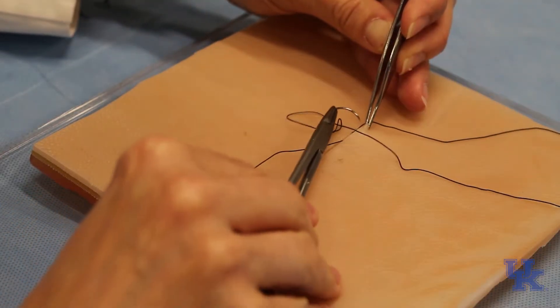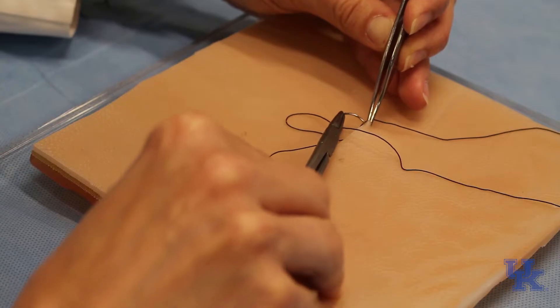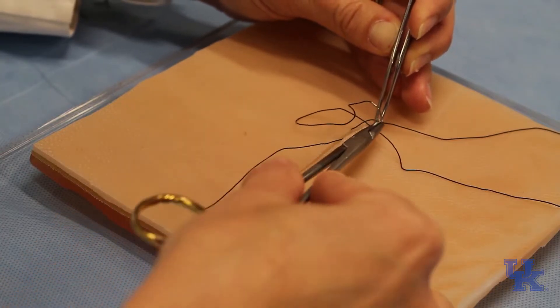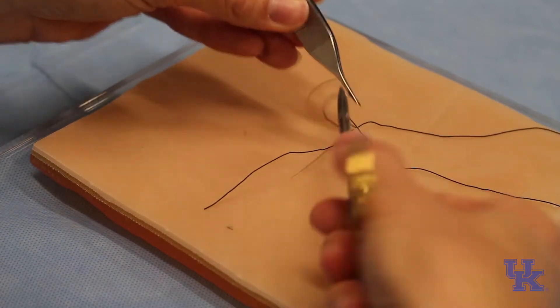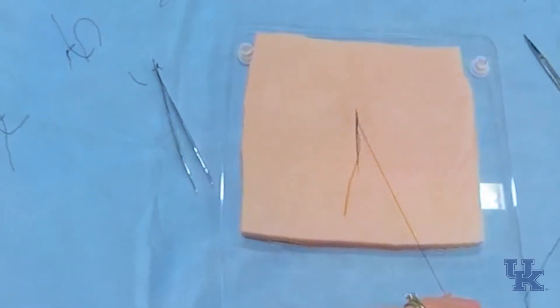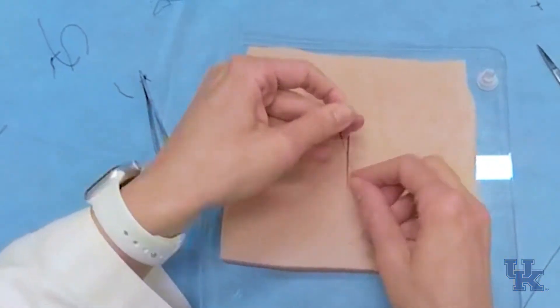Change the way I hold the instrument, go back in just below the epidermis, back to deep. So this is the same as what we just did, and you're going to tie a knot.